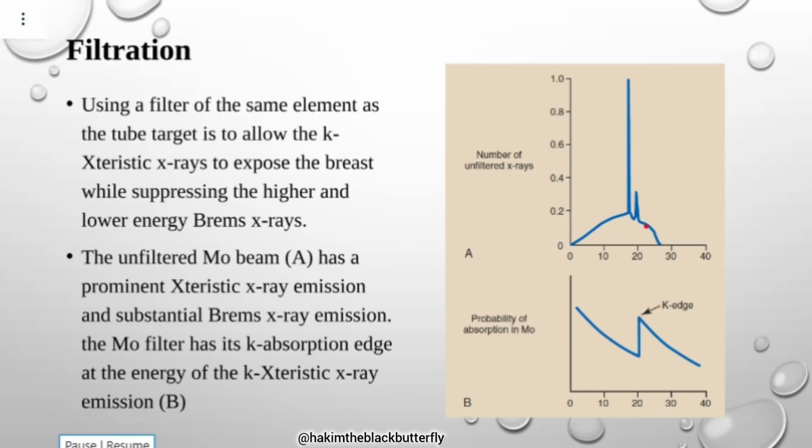Does mammography only deal with the breasts? Salome Faith, do you know what mammography means? Yes, it is a machine designed specifically to image breasts.